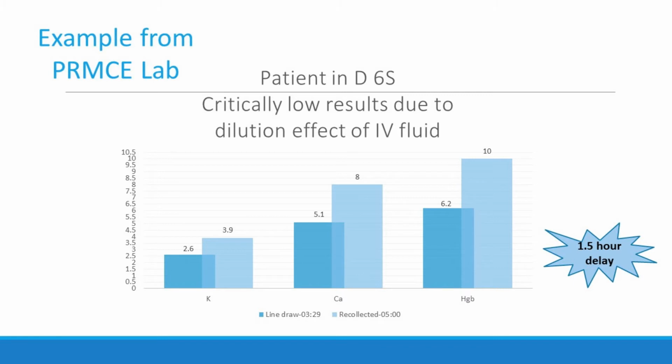Here's an example of critically low results due to dilution effect of IV fluid. You can see once the patient was redrawn, the results were quite a bit different. So it's just really important to make sure that we pause that IV before we're collecting that sample.